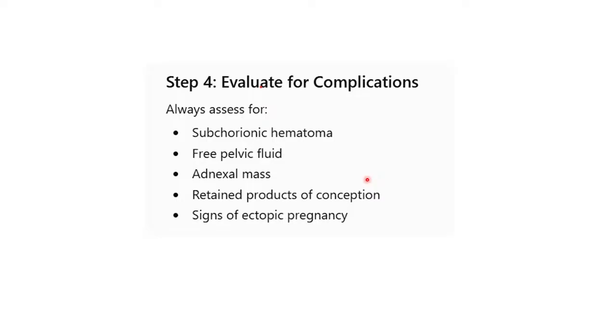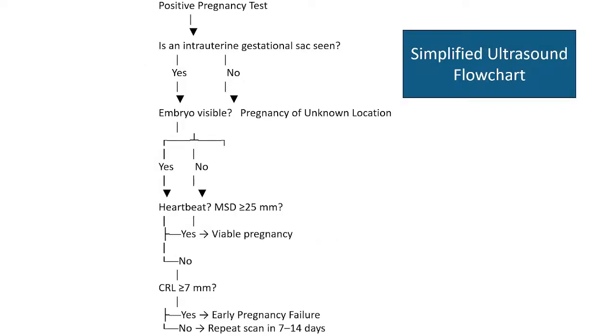So there's a lot involved in giving a good report and also in saving a pregnancy until it is delivered. Retain the products of conception if they are there. Then signs of ectopic pregnancy, you also have to take note of those. Now, this is a simplified ultrasound flowchart of the events that ought to be followed in that hierarchy, in that order.